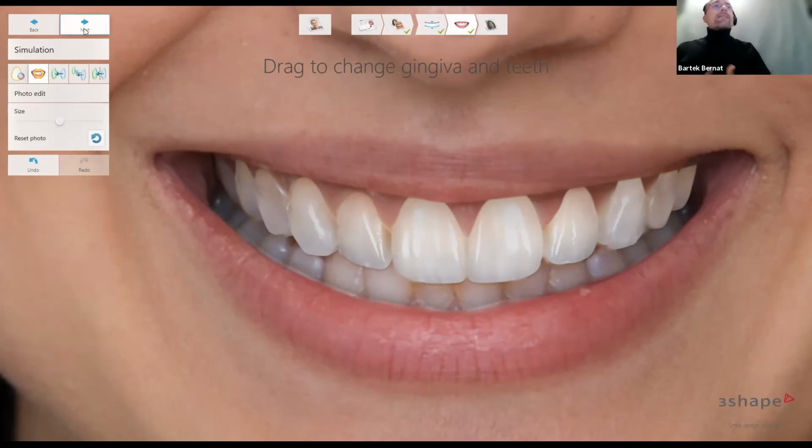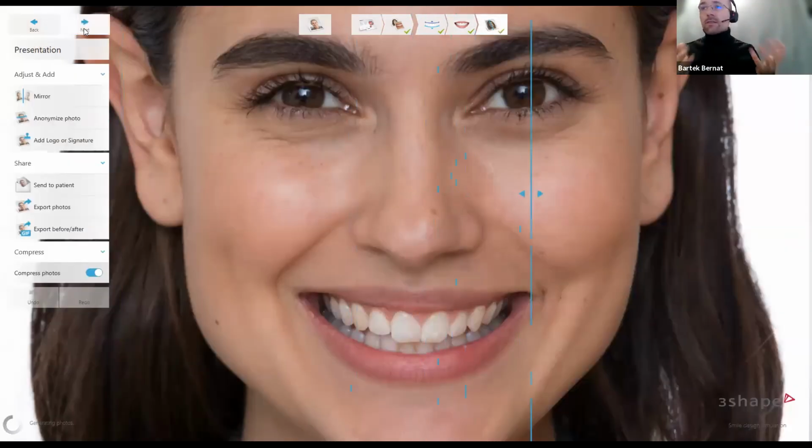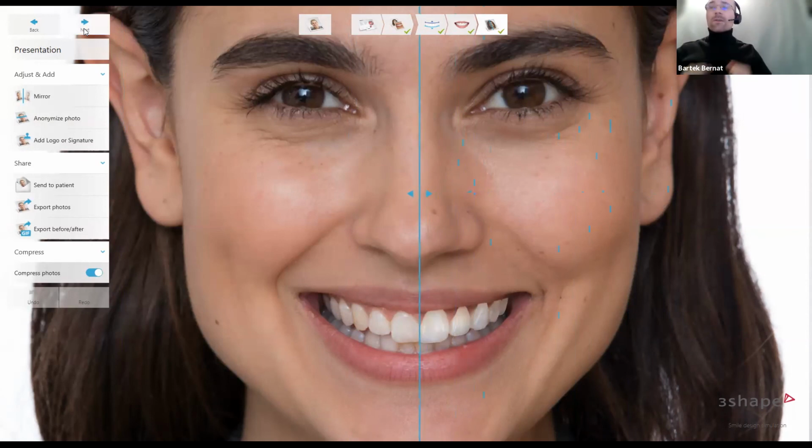Okay, and this is now the part that you're showing to the patient. So as you can see, that was very quick and simple. Now you can show the screen to the patient. If you have moved, for example, you can just go towards him or her and check the difference, how you may look. And as I said, it's also possible for the lower teeth as well. For that, I would of course advise you to have a more retracted view for a better view. So yep, that basically concludes this.